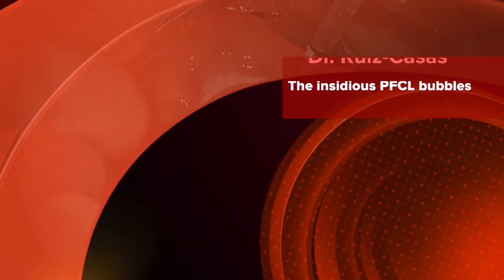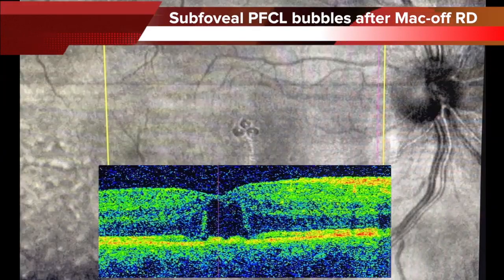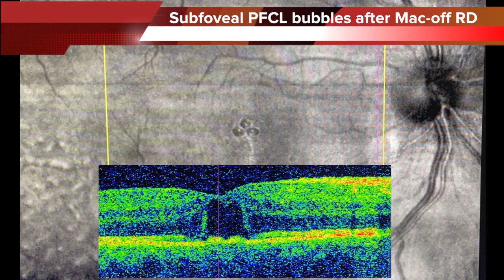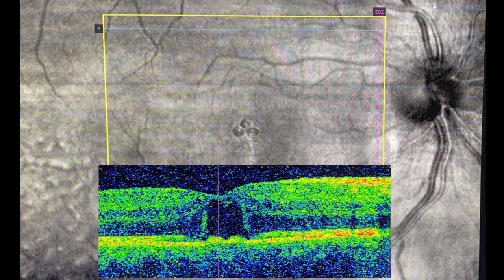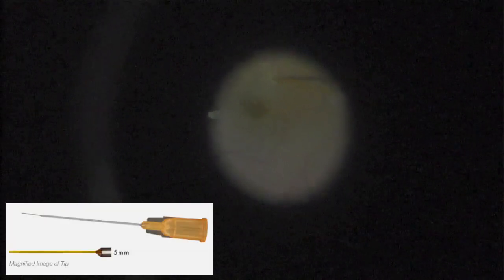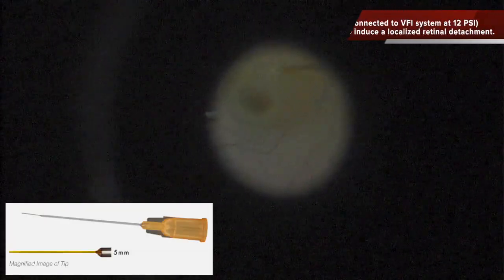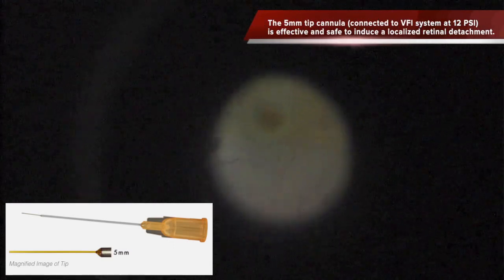This is a case of persistent subretinal PFCL bubbles in the foveal area after a macular retinal detachment operated with vitrectomy and gas. In this case, the first surgical approach was displacing the subretinal bubbles to the inferior retina in order to avoid the need to aspirate the bubbles under the foveal area.